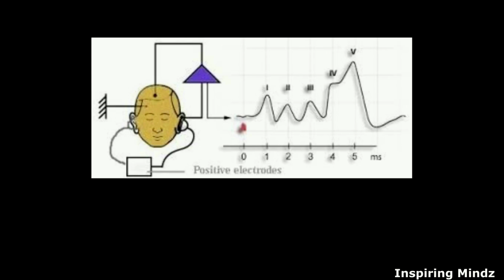First, how many waves are present? In a normal individual, 5 to 7 waves are present. If a one word answer is asked, you can go for 7 waves, but mostly the 6th and 7th waves are not important for us. So we can remember that there are 5 to 7 waves. If a one word answer is asked, we can go for 7 waves.